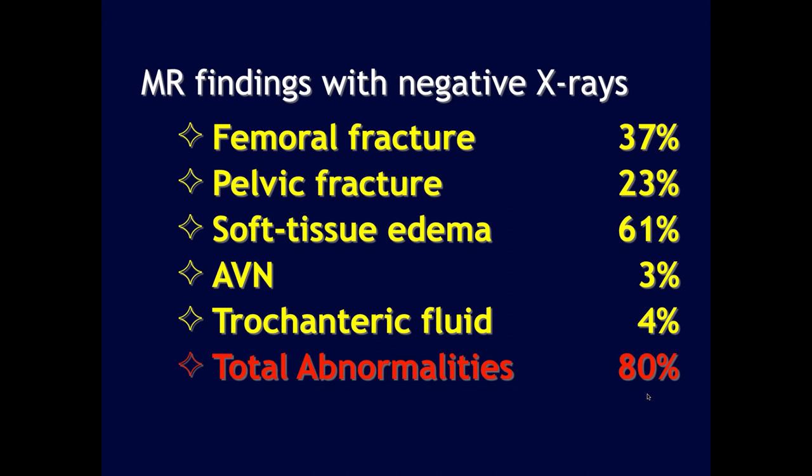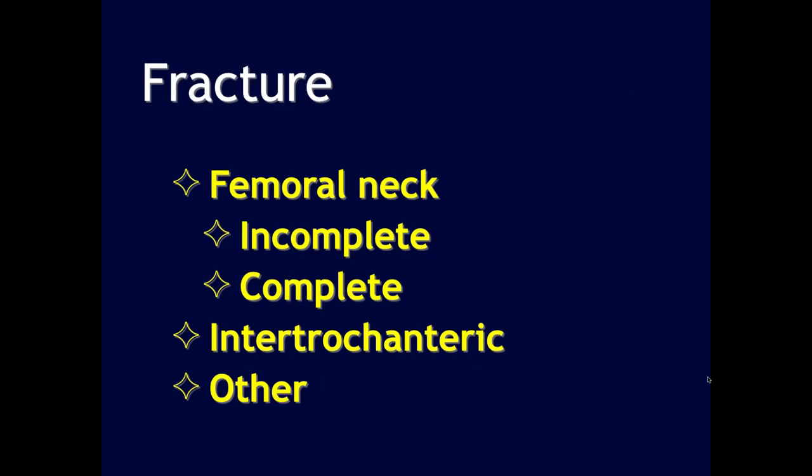So our recommendation at that time was, if you're concerned about x-ray negative injuries to the bone, you really should do an MR scan. This was in the early days when it was not at all recognized that MR could evaluate bone disease. In fact, it was generally felt at that time that MR was not a technique that could evaluate bone. So let's go on and talk about other fractures, femoral neck fractures, both incomplete and complete, intertrochanteric fractures, and some other kinds of fractures.